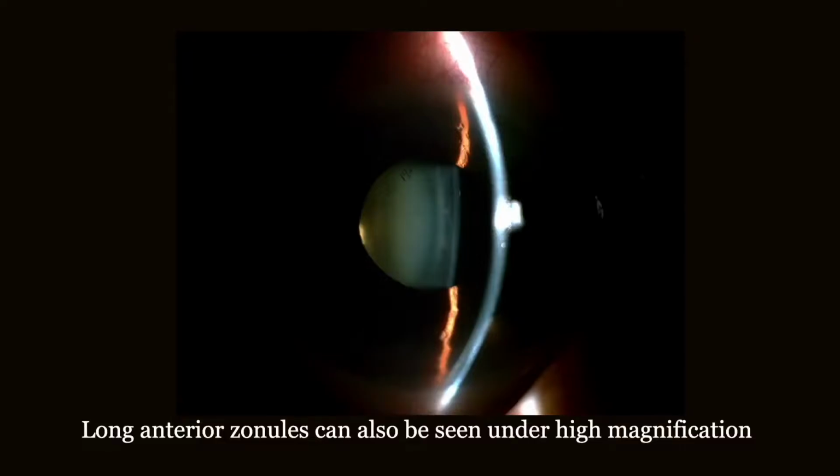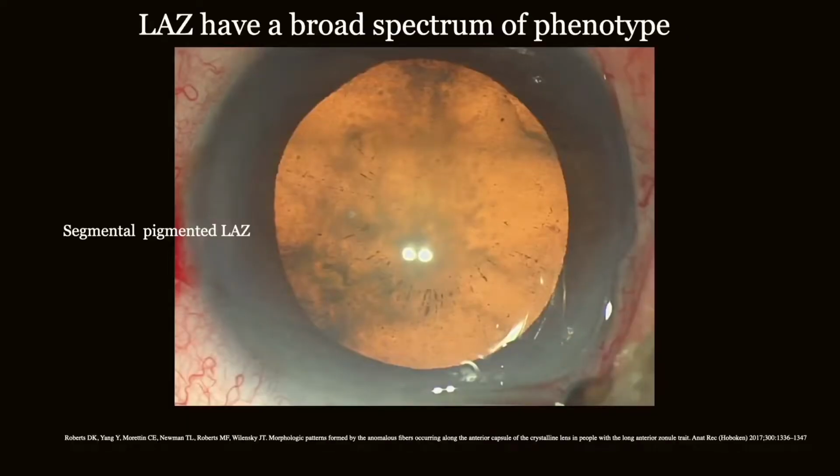Another trick is to look at them under high magnification and bright light. They have a wide phenotypic spectrum. They may be pigmented, segmental, complete, or mixed. The size of the zonule-free zone is variable.